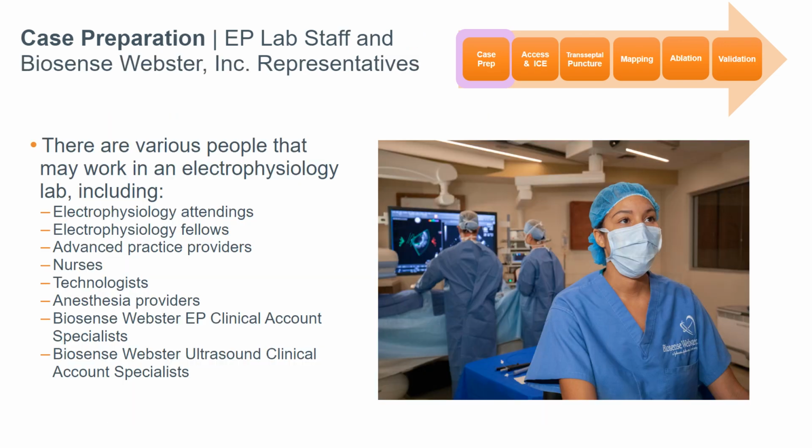There are various people who may be working together during an ablation procedure. Roles and responsibilities vary by state and hospital, so check with your institution for specific responsibilities. Electrophysiology physicians, fellows, and advanced practice providers may obtain vascular access, perform catheter manipulation, pacing, and ablation. Nurses and technologists may be responsible for patient preparation, medication administration, monitoring, and documentation.